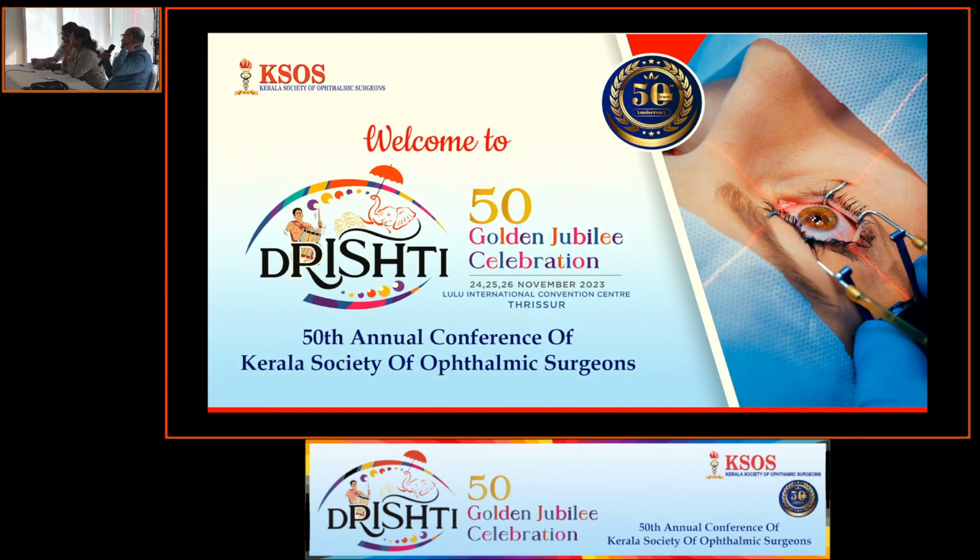Where do you tend to put this diagnostic test? Do you find this test will place in the homeostasis marker? Yes, sir, because the ocular surface thermography gives you an idea regarding the homeostasis maintenance. So in those people who have a higher severity score, it shows that the patient is not able to maintain homeostasis. So it definitely is an important parameter to analyze.